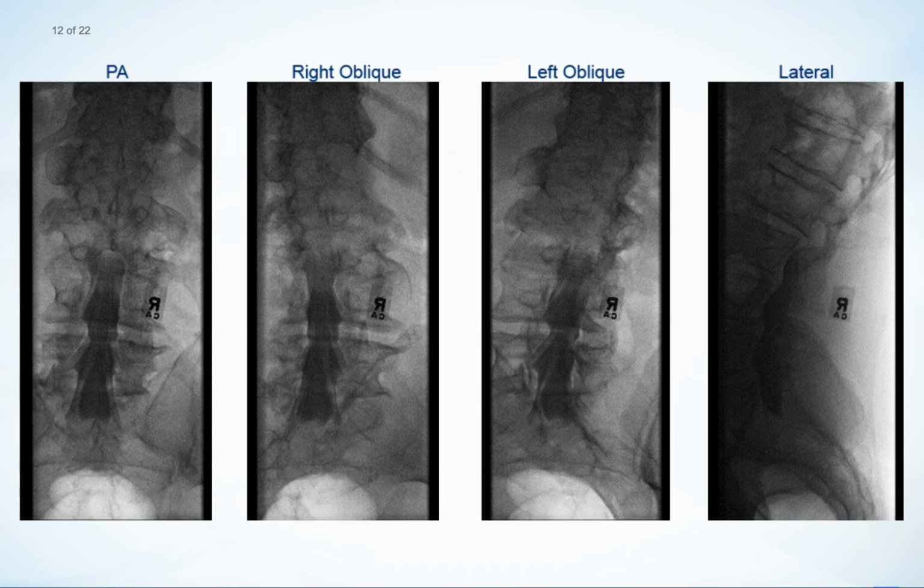After fluoroscopic or conventional images are obtained, the patient is moved to a stretcher. Avoid abrupt or active patient movement. Instruct the patient to remain passive and move the patient slowly to the stretcher. The patient is then transported to CT by stretcher for sectional imaging.